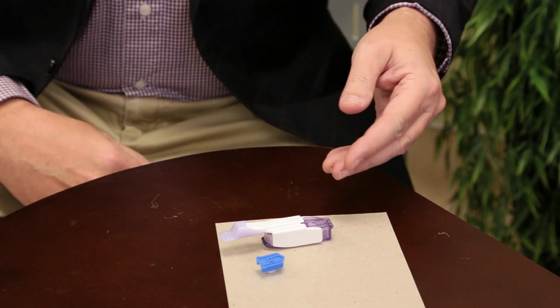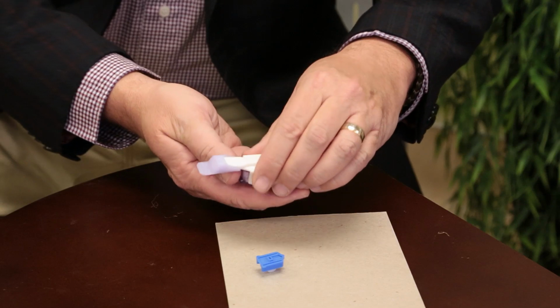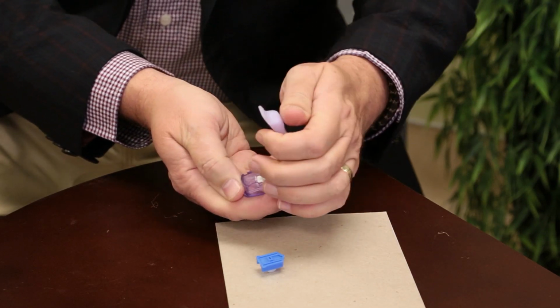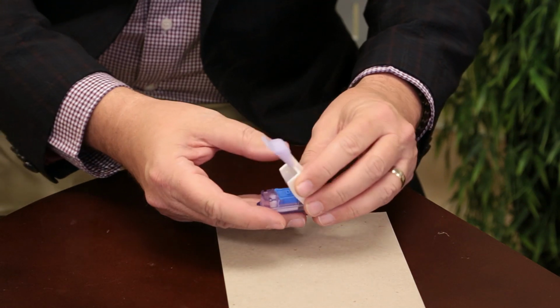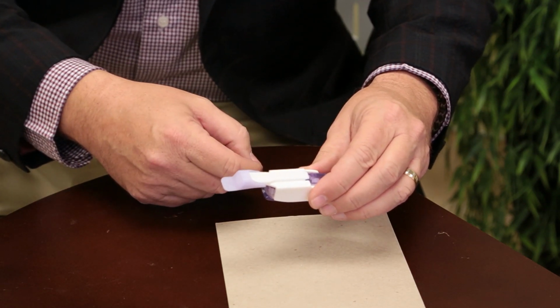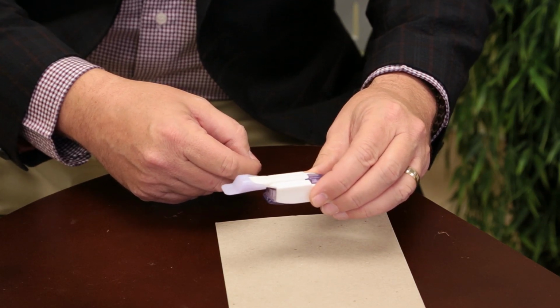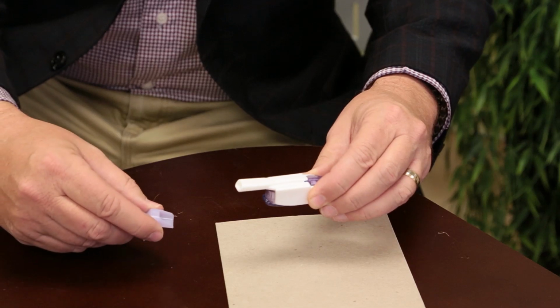So this is the inhaler for the inhaled insulin. This is the insulin itself, and all you do is open it up, line it up, drop the cartridge in, close it, and it's ready to go. It contains about 10 units of insulin, but once it gets into the body, it's about 3 units. And then you just take this off and inhale. It's very straightforward as far as loading the device, taking the insulin. There's no needles involved, and the insulin gets in quite quickly.